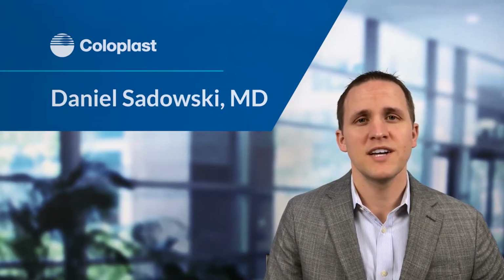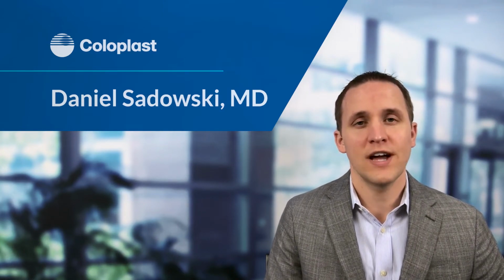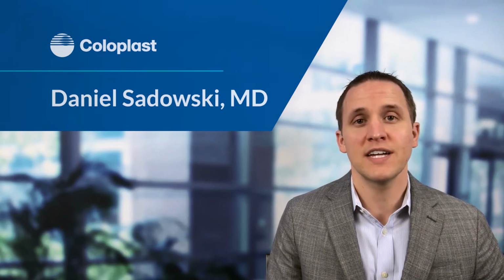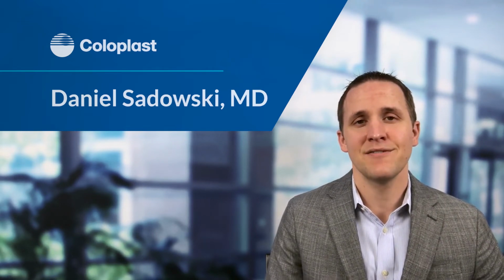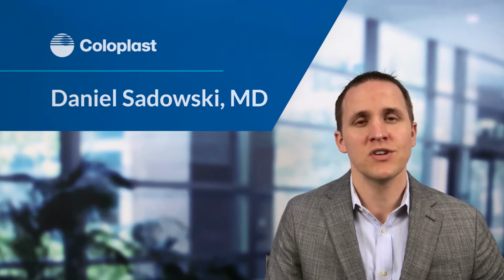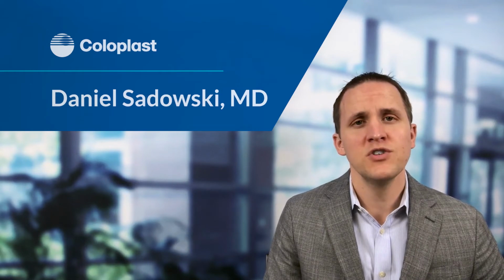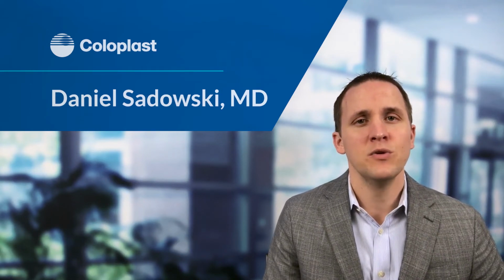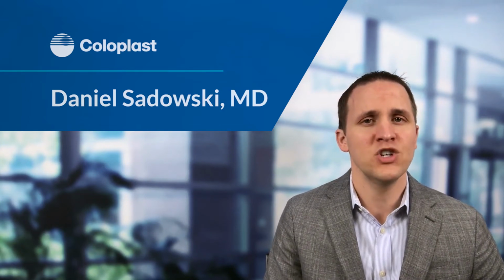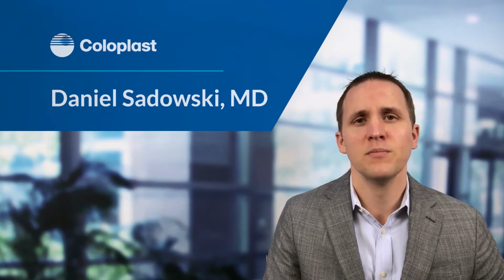The penile prosthesis will allow you to have a rigid erection. It will provide a firm penis for sexual activity. It does not affect orgasm or sensation or ejaculation. However you were before the procedure for the penile implant is how you would be after in those regards for sensation, orgasm, and ejaculation. So the implant is only providing a firm erection.